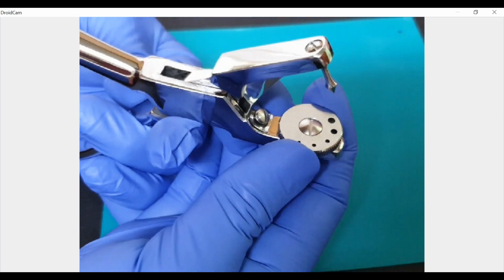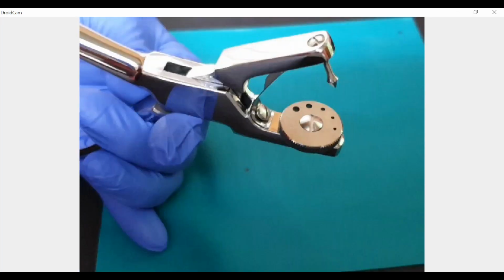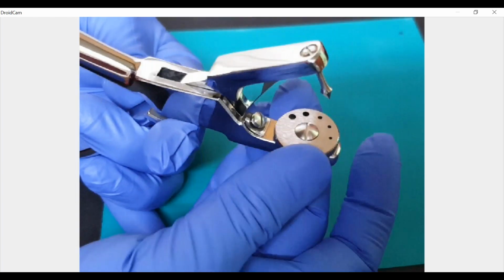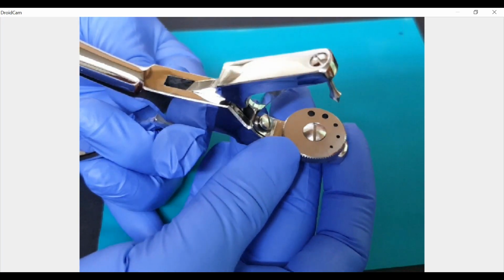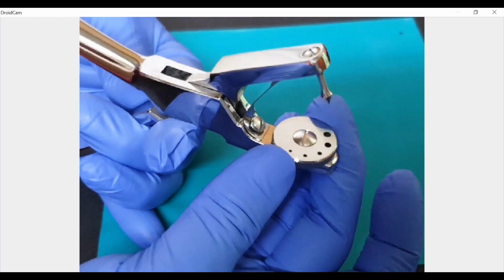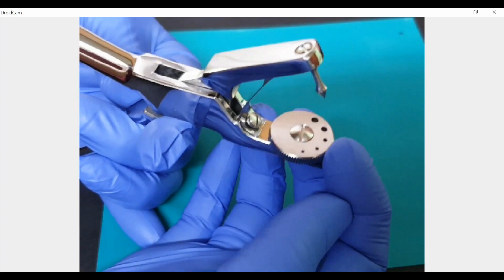So there are multiple holes on them. And believe me, if you were to use the very small holes which are indicated for anteriors, lower and upper anteriors, it would be a little difficult for any beginner or a routine user to elongate the rubber dam sheet onto a winged clamp. So I would suggest we stick to the largest 2 holes for molars, and for the rest of the teeth, let us stick only to this one.